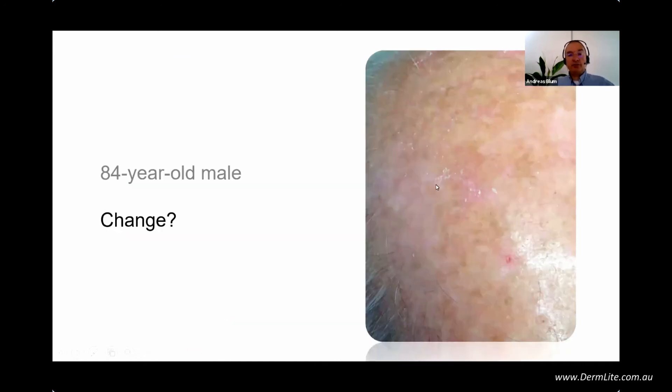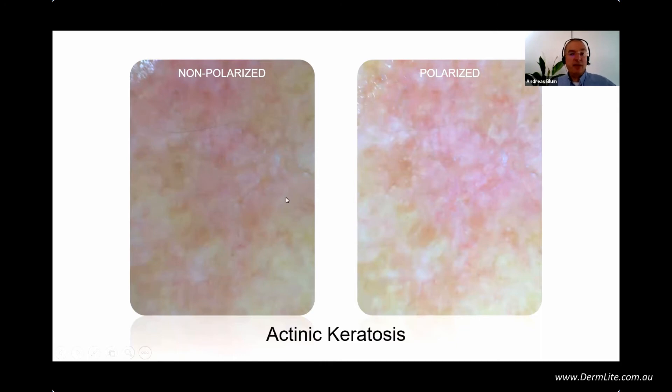Next patient: older male, more than 80 years old, with a lesion on the scalp — change. I like to encourage you to touch it — you see it's a little bit rough. With non-polarization and then polarization. When you have a man on the scalp with a rough lesion and UV-damaged skin, it must be actinic keratosis. In polarized light you see shiny areas and rosettes — four little dots located as a rosette. Then you know exactly you have an actinic keratosis.